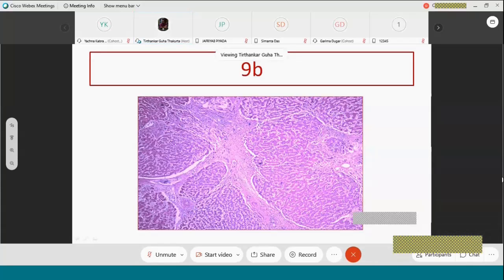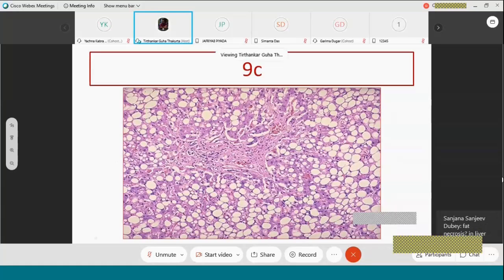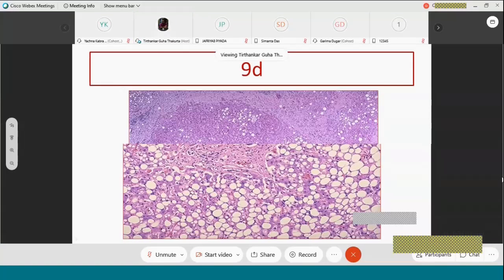Identify the tissue and the diagnosis. What kind of change do you see in the organ? Very good. So this is the liver identified by the portal triad that is present in between. And there are some residual liver cells also. Some of the liver cells have undergone swelling or ballooning and filled with lipid substances. Therefore, this is fatty liver. What is the diagnosis for this?